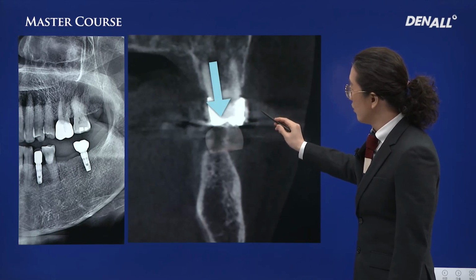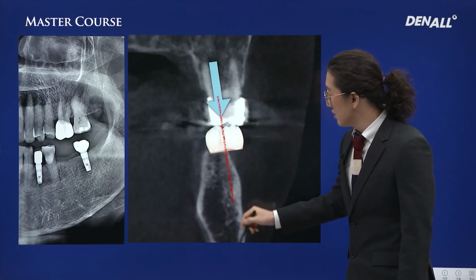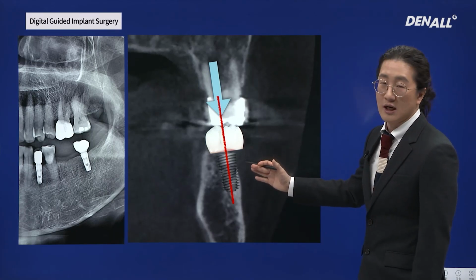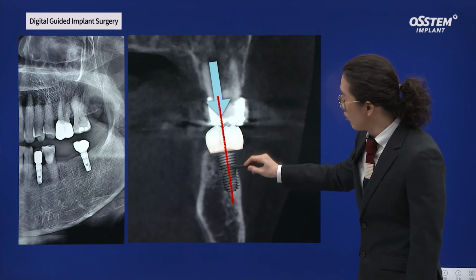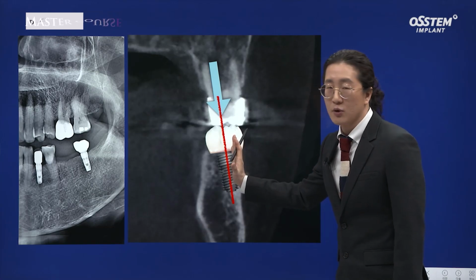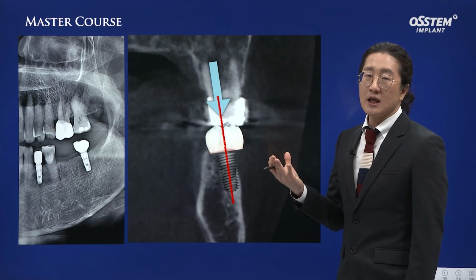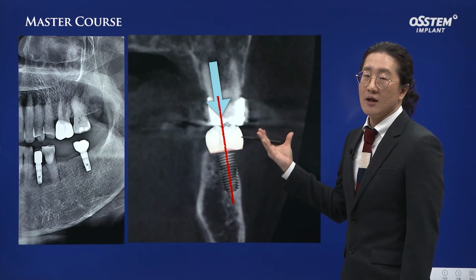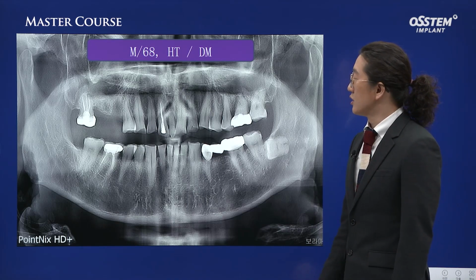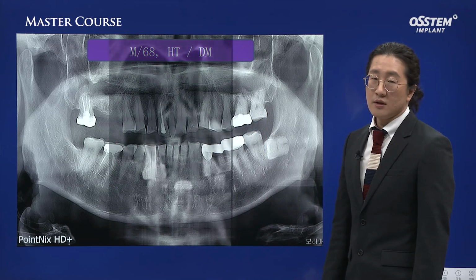If we align the crown on the model accordingly with the upper and lower teeth, the implant should be positioned here. However, we cannot realistically place it here because there's too much defect on the buccal side, so we need to make a compromise and change the implant position. We cannot make a guide only based on surface data. There can be issues.